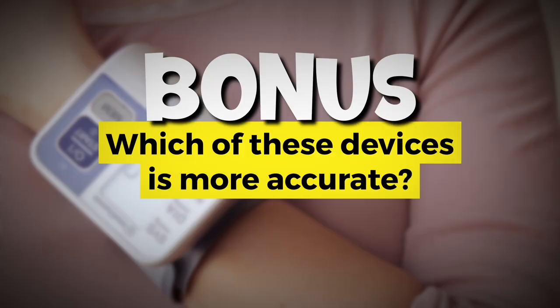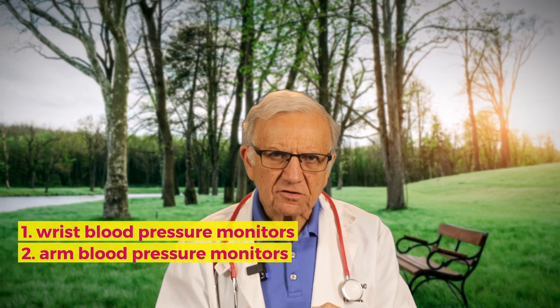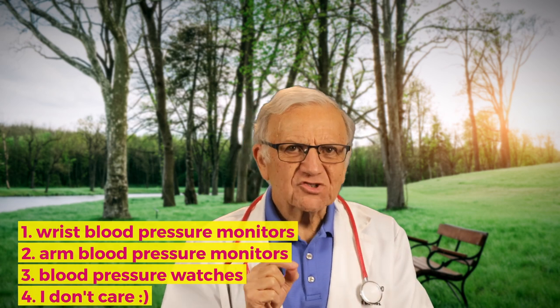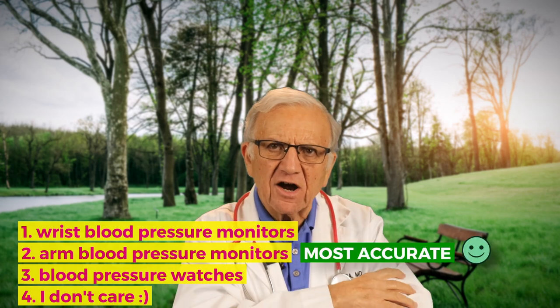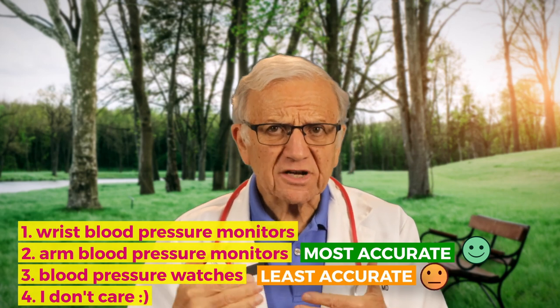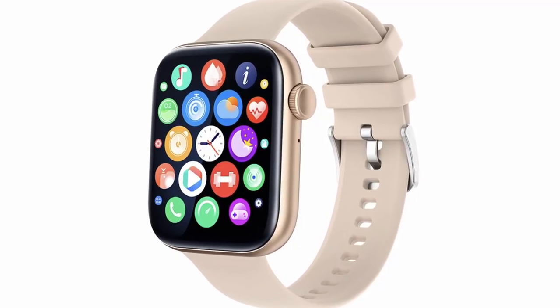Here's the bonus question I promised: which of these blood pressure devices is most accurate? Number one, wrist blood pressure monitors. Number two, arm monitors. Number three, blood pressure watches. Number four, I don't care. The most accurate blood pressure machine is the upper arm cuff. The least accurate is blood pressure watches, which provide continuous readings and other parameters including ECG monitoring, heart rate, and sleep tracking — and they're very stylish and expensive. I'm sure in the future they will get better and more accurate, but at this point they are not.